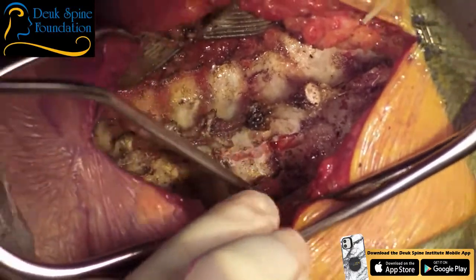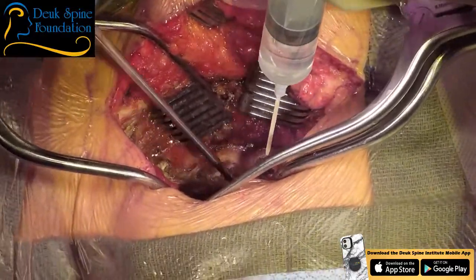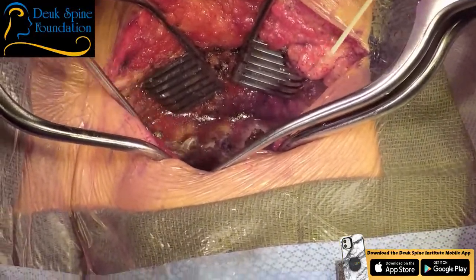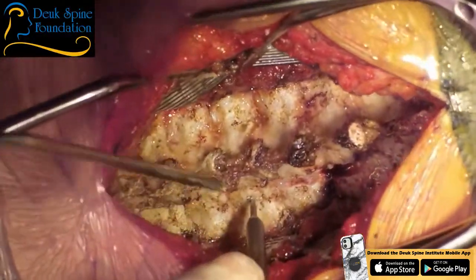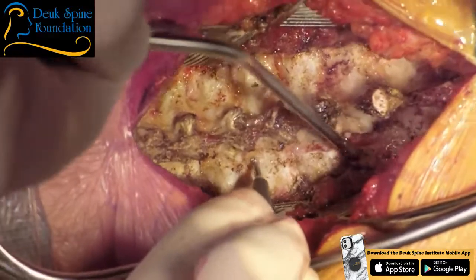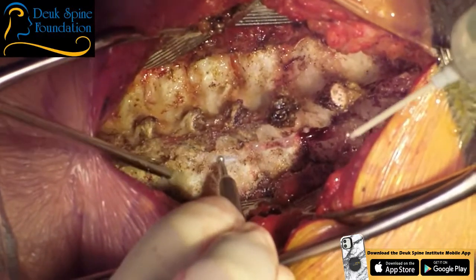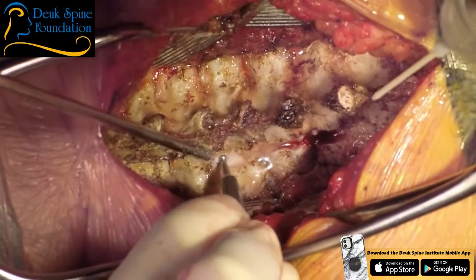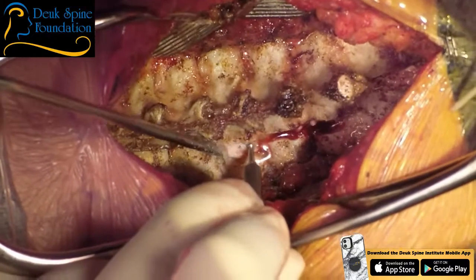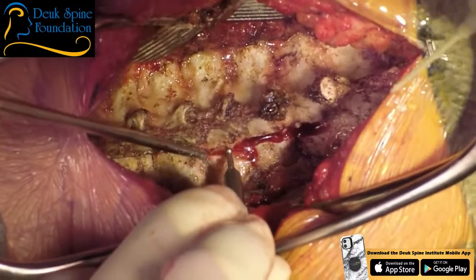Oh, by the way, we're drilling on top of the spinal cord, so you really want to be careful. Don't try this at home, in your garage, kitchen table. This is pretty serious stuff. Just because you watch me do one doesn't make you capable of doing it. There's a lot of tactile feedback you're not getting when you're watching.